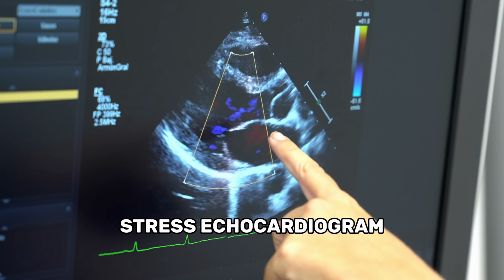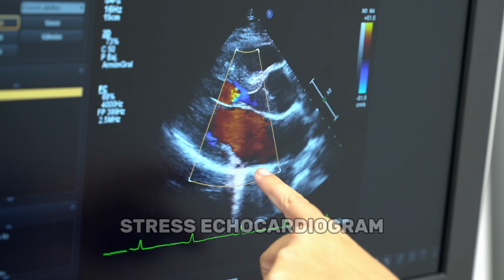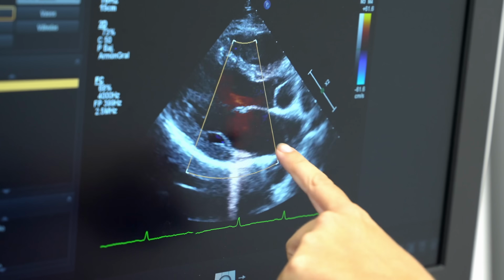But the next one would be stress echo for us. And so everyone's not getting a stress echo. So this is someone who's going down a path of diagnosis, and then you say, okay, well now we need this extra piece of information. Right, and the physician has to choose wisely. You listen to the story, you have a pretty good idea. We call it the pre-test probability of what's going on.